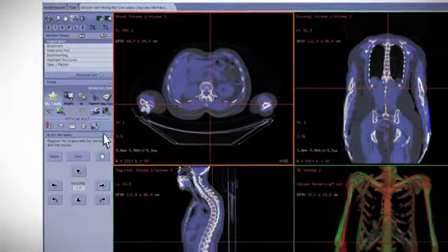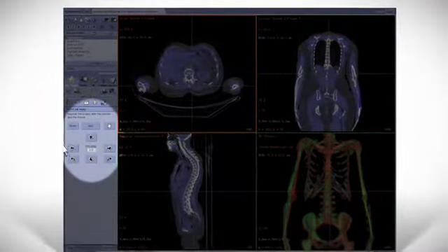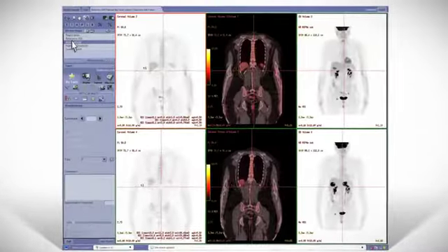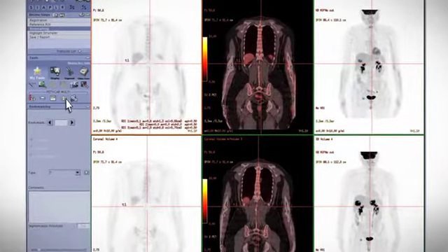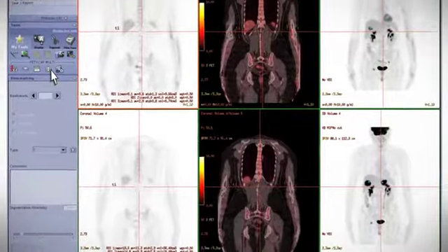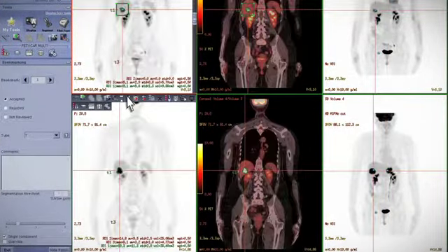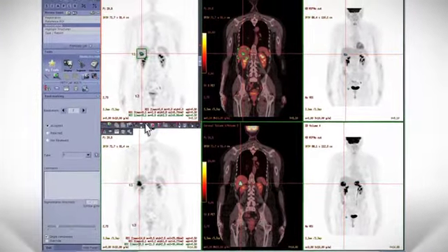While it automatically aligns the two images, the user always has the ability to fine-tune the registration if necessary. The review screen is displayed showing baseline and follow-up exams. Once the two exams are aligned, the lesions from the baseline are automatically propagated to the follow-up exams.